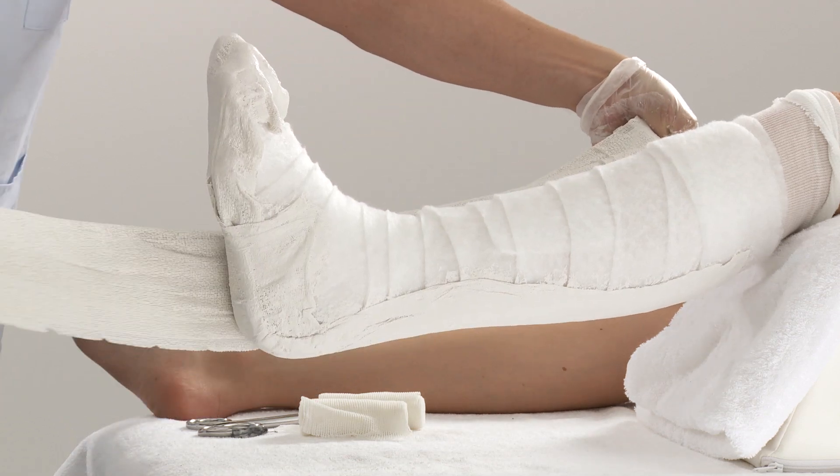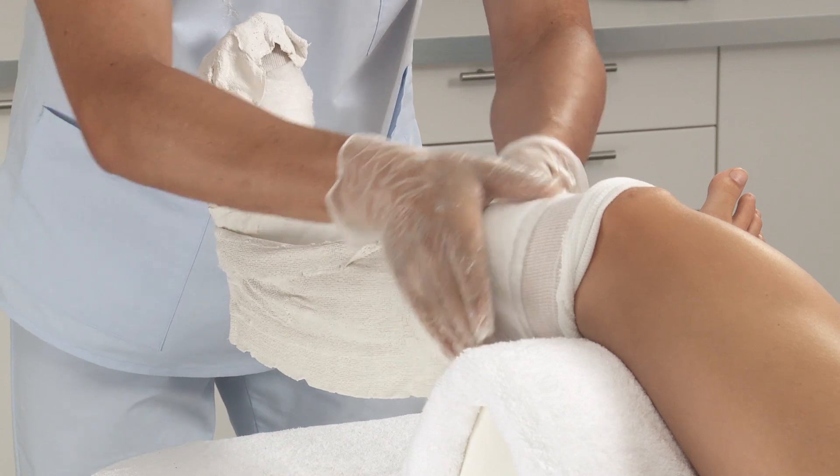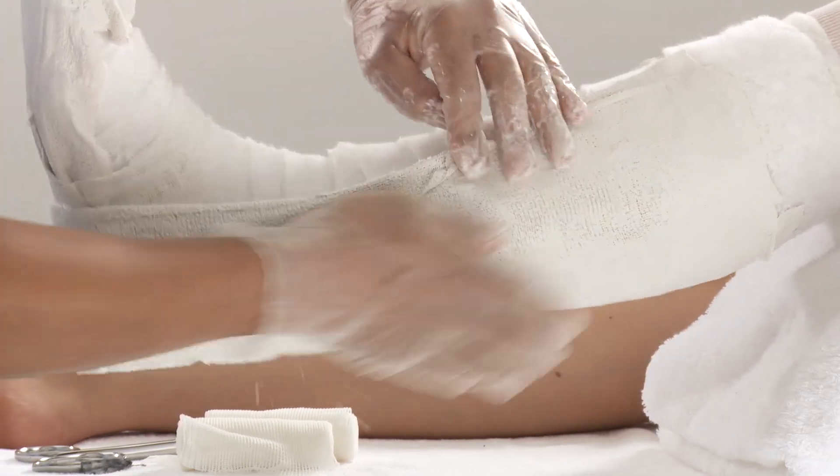Apply a second activated splint from the lateral side, around the sole of the foot, to the medial side. Smooth down.